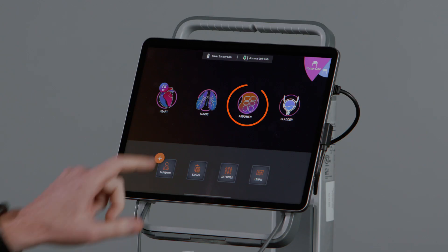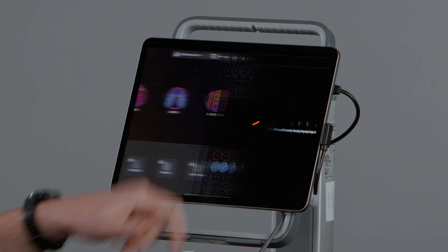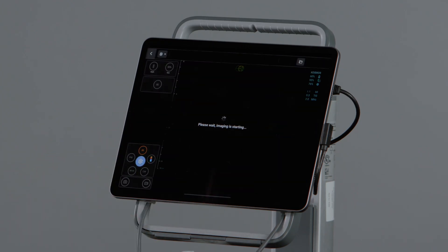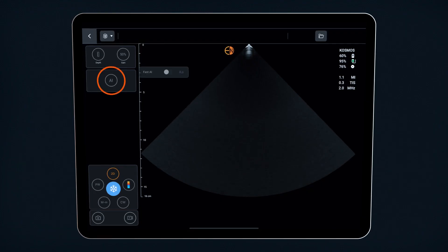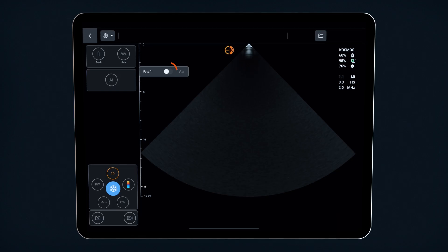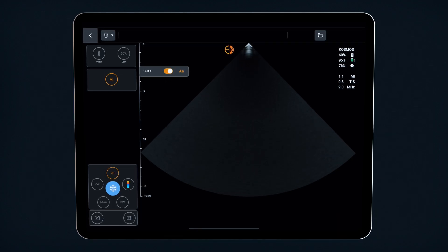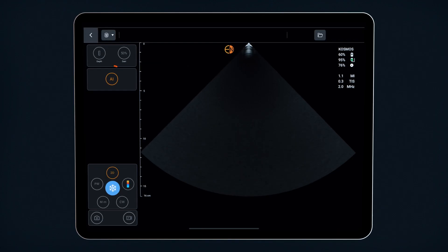First, select the abdominal preset. To enable AI-FAST, tap the AI icon on the left panel. Then toggle on FAST AI, and this will enable the AI highlighted in orange.